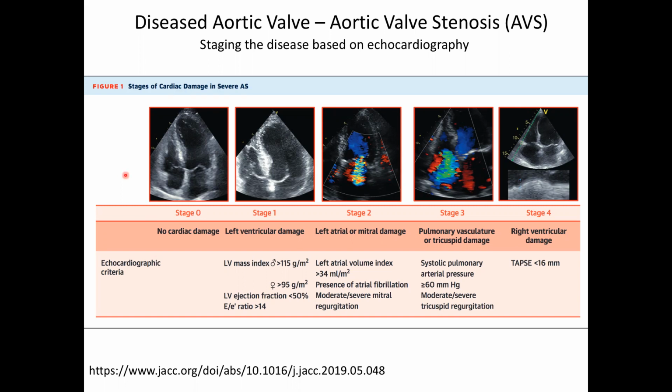And as we've said before with echo, having a really good physician look at your case is probably the best thing, because that person has all of these stages programmed in their head. They don't know how they're doing it, but they know, oh, that person's really severe, that person's okay, right?